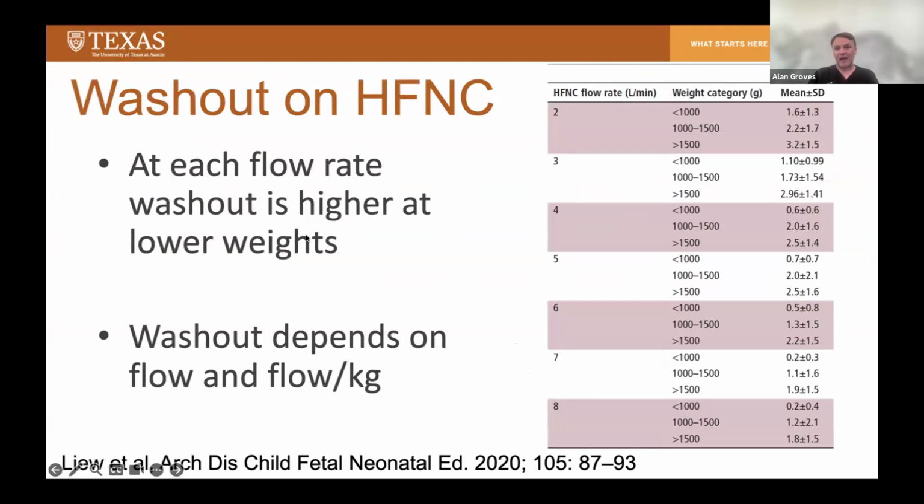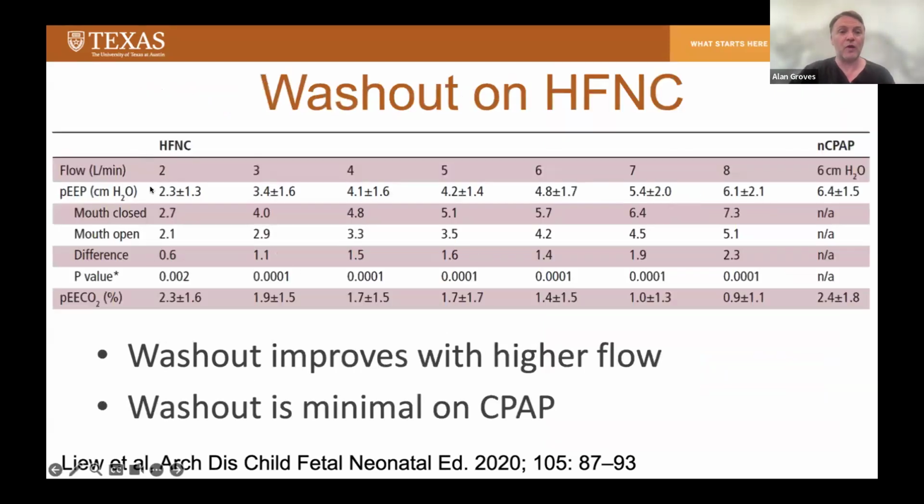One of the things that's going to come up time and again in this talk is whether we should be thinking about our high flow dosing in liters per minute, or whether we should be thinking of it in liters per kilo per minute. Unfortunately, there's no one-word answer to that question. So I'm going to talk about both each time so that we can look at the pattern each time. So here is the high flow rate just in liters per minute.